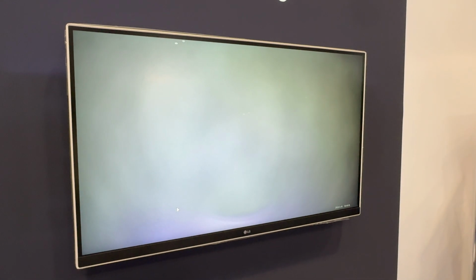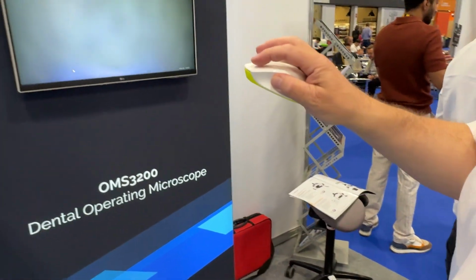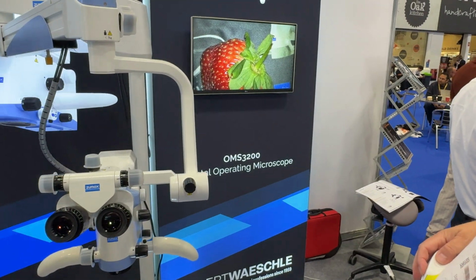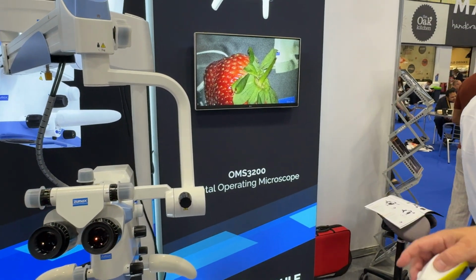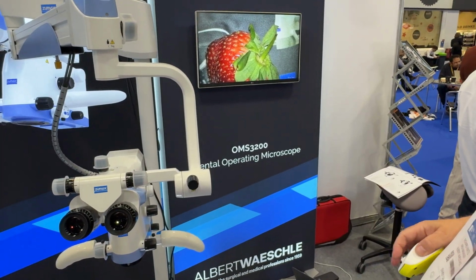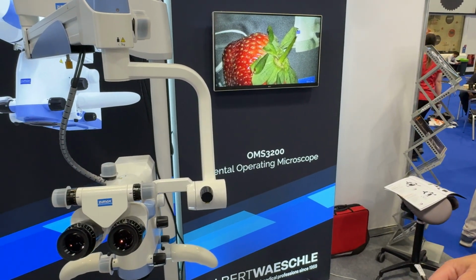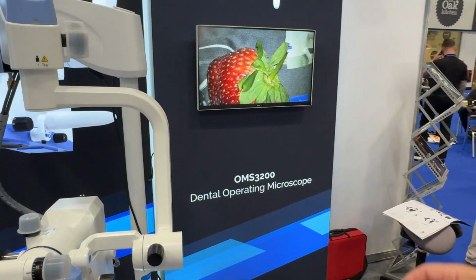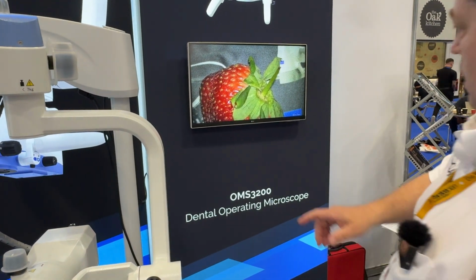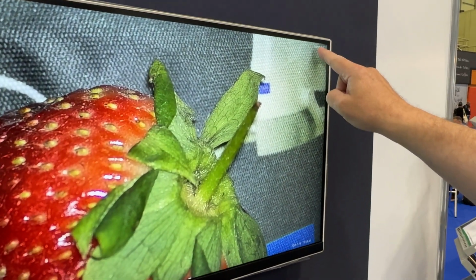And you can also take photos with this mouse. If I'm on there and I want to take a photo, just press one side of it. If I want to take a video, just press the other side, and then that will scroll down. You can record and take pictures at the same time. So that's recording now. You can see that that's recording because the timer is showing on the right-hand side of the screen.